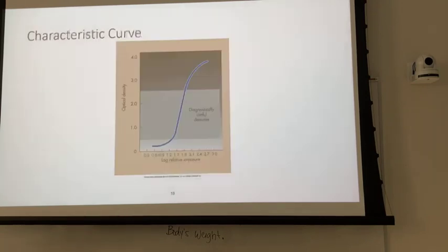So we'll go back to the H&D curve here. And again, this would be a very high contrast H&D curve. A low contrast for chest X-ray wouldn't be at a 45-degree angle, but it would be more horizontal than this one. Okay. So what we're looking for again is shoulder portion. All the densities bleed together so that we lose contrast because it's too high of an exposure. And it can happen if you totally flood your image receptor. If your exposure gets too low, then again, you're going to lose contrast down here in the toe portion.